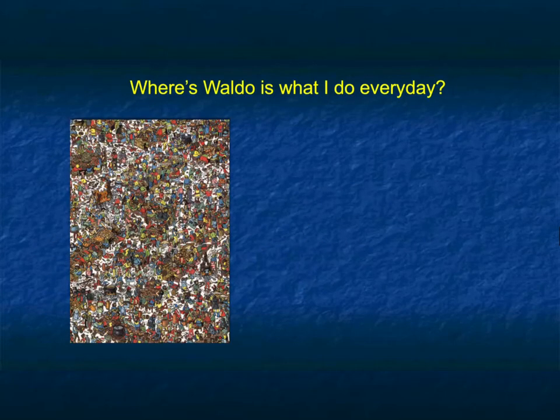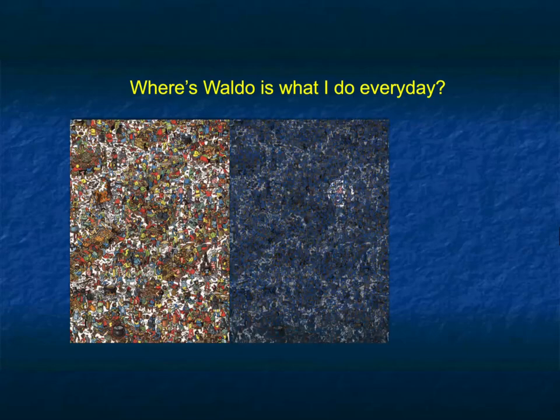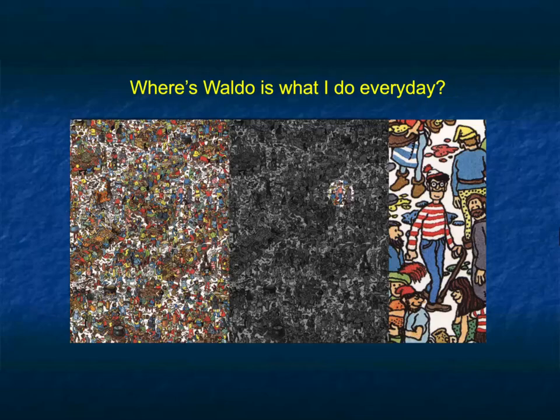Now, the challenge is what we do in CT, or what we do in many parts of imaging, it's kind of like Where's Waldo? There's a lot of information in the image, and we're trying to find something, in this case, Waldo. When you see it, it's great, but you could spend a lot of time not seeing Waldo. And many times, it's not that we're saying rule out pancreatic cancer. If someone says rule out pancreatic cancer, perhaps you'll pay more attention to the pancreas. But if it's just vague abdominal pain or a little bit of back pain or just vague anything, yes, you're looking at the pancreas, but perhaps not as carefully as you could because you have many cases to read and you need to look at the pancreas, the liver, the kidneys. You need to look at the spleen, the bowel. There are many things we need to look at.